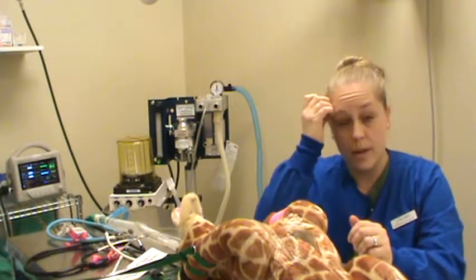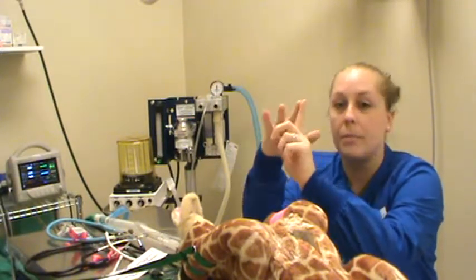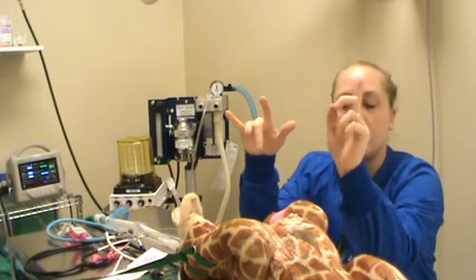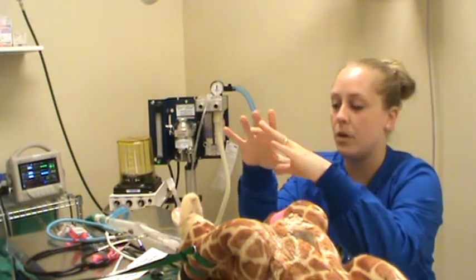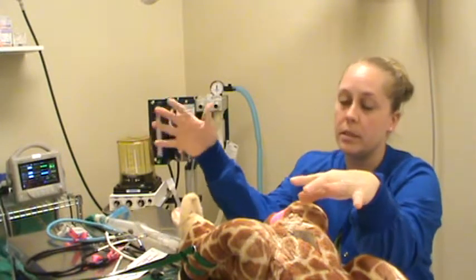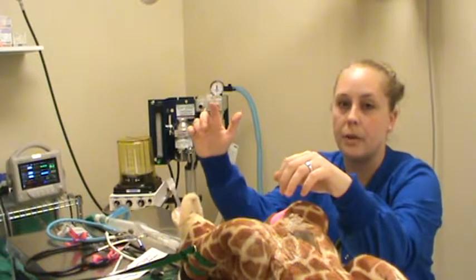First thing I'm going to explain is what this video is going to cover. So we're going to go over heart rate and rhythm, blood pressure, mucous membrane color and CRT, respiratory rate and rhythm, and body temperature. Those are the parameters we're going to be monitoring, as well as end-tidal CO2 with our little capnometry.